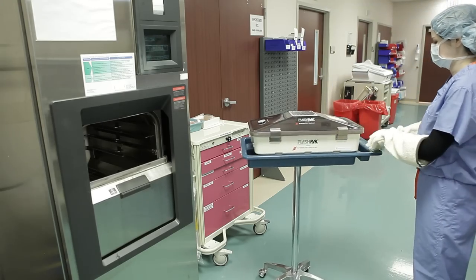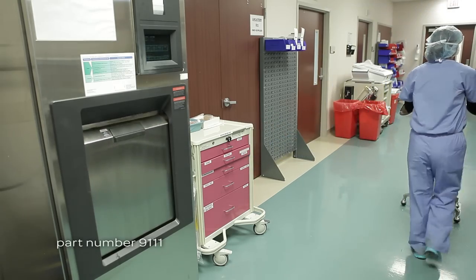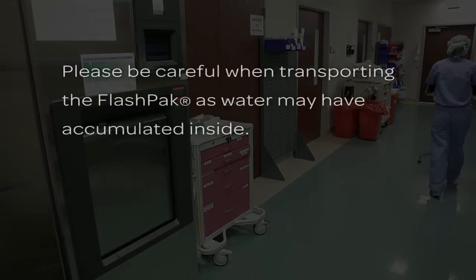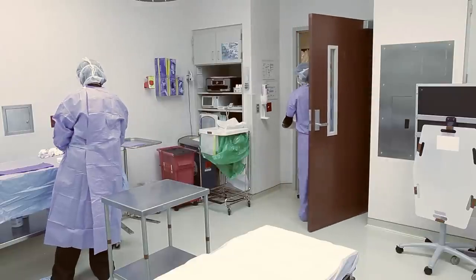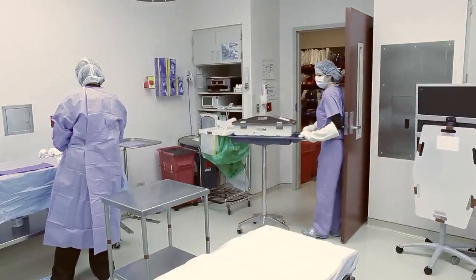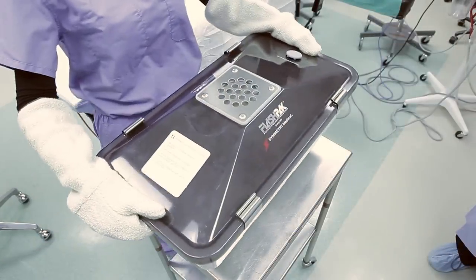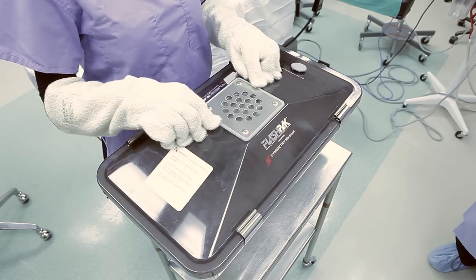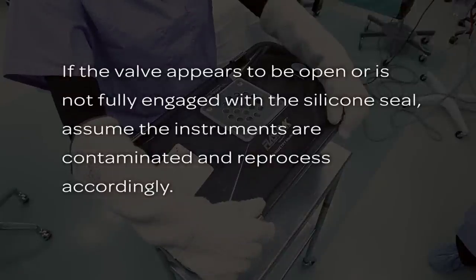Transfer the FlashPak to the delivery cart, part number 9111, or other suitable cart for transport to the point of use. Please be careful when transporting the FlashPak as water may have accumulated inside. The FlashPak may be placed on non-sterile surfaces. Place the FlashPak on a table near the point of use and visually verify that the valve plate in the lid fully seals the entire circumference of the silicone vent gasket. If the valve appears to be open or is not fully engaged with the silicone seal, assume the instruments are contaminated and reprocess accordingly.